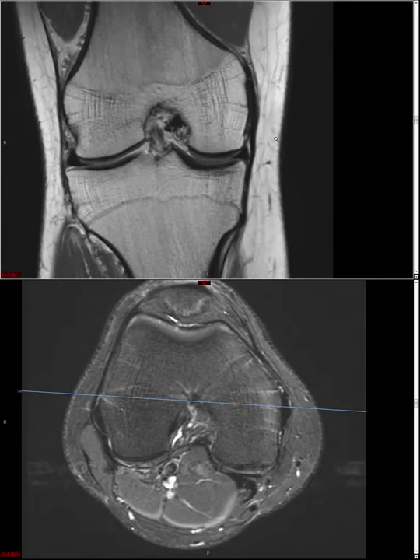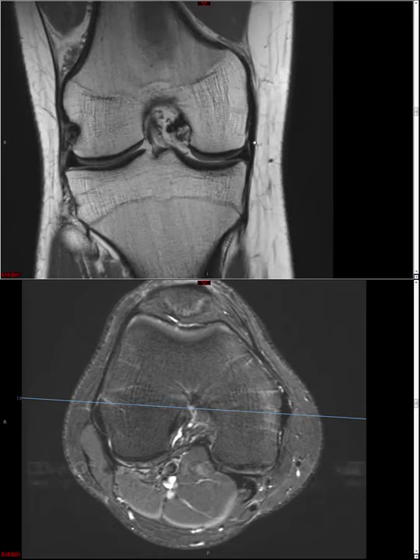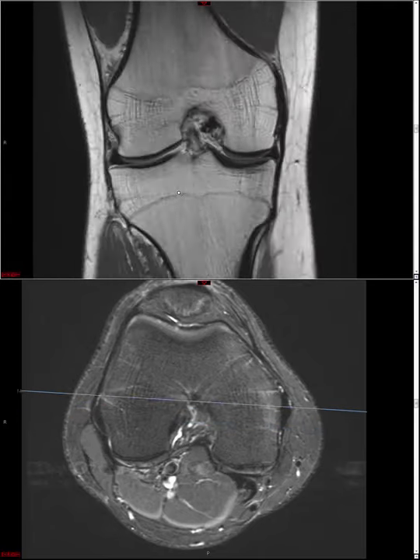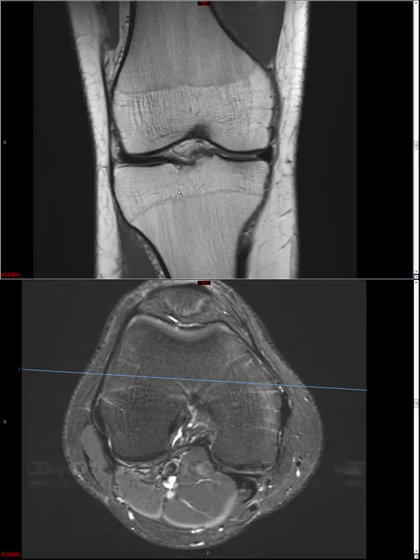Sometimes it's helpful to say if it's the proximal third, distal third, or in the mid-substance, or middle third, I should say. Great. Okay, so there are more structures on the lateral side, so it can be a little trickier, but not too bad if we approach it systematically.